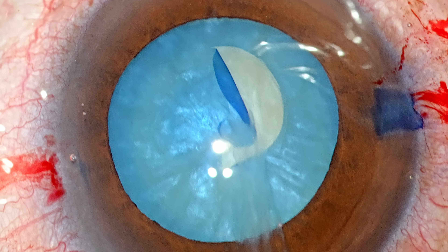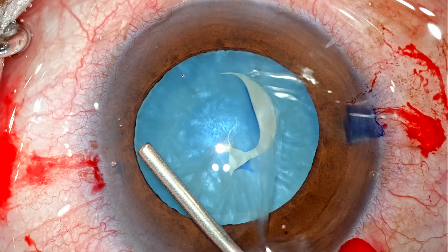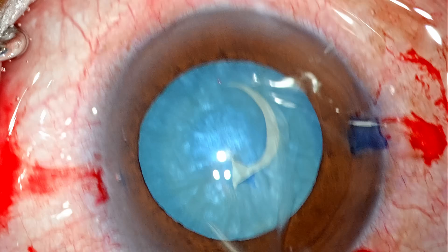So immediately I come out. I want to re-pressurize the eye and ensure the chamber does not shallow. I go in and inject OVD.